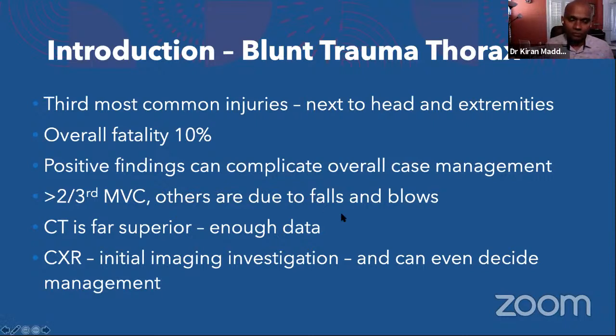And then others are due to falls and blows or assaults. And the CT is far superior. We have enough data, but today I'll try to make sure you understand what exactly you have to do when you look at a chest X-ray, or what we are doing when we look at a chest X-ray.